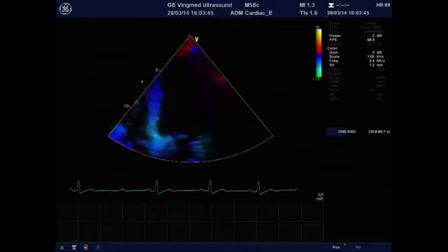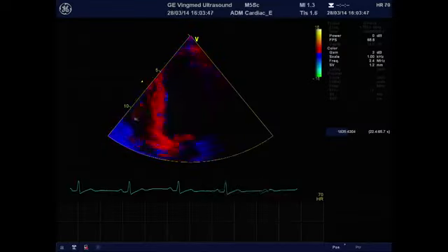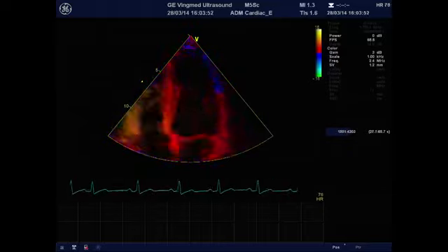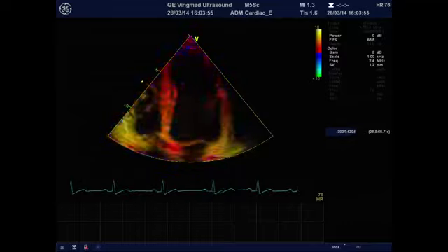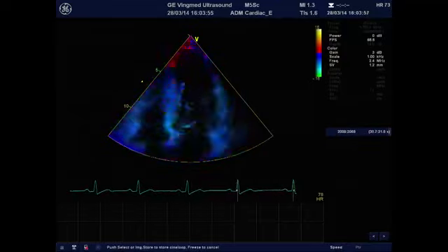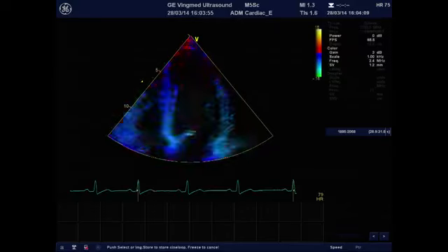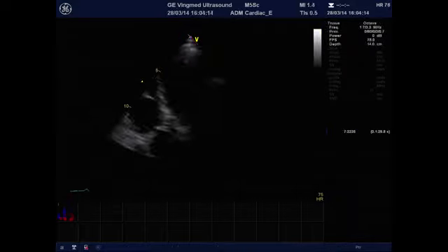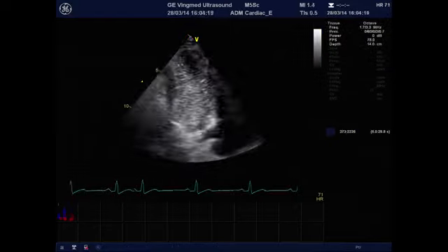If you have this image, you ask the patient to hold breath, and then you can acquire your images. Can you please stop breathing? Breathe out and stop. I'm usually acquiring 3 cardiac beats, not only 1. Tissue Doppler can sometimes be a bit noisy, so it's good to have 2 or 3 beats to compare. I increase therefore the acquisition to 3 beats and store this image. That's basically it. And now you move to the 3- and 2-chamber view and repeat the same procedure.